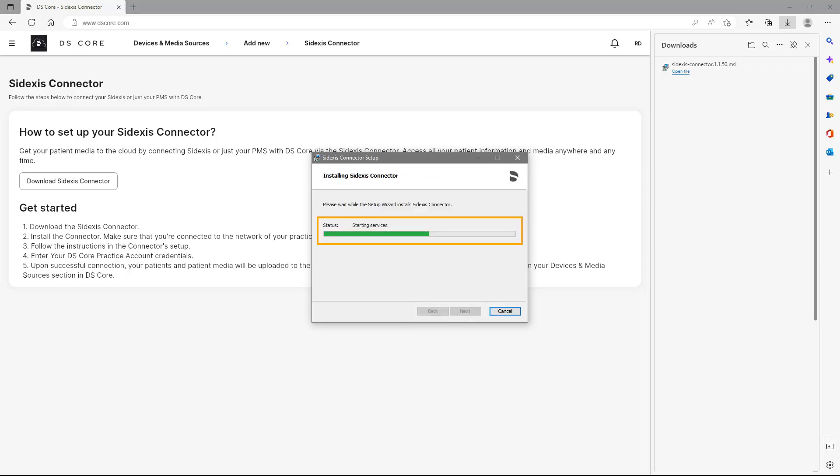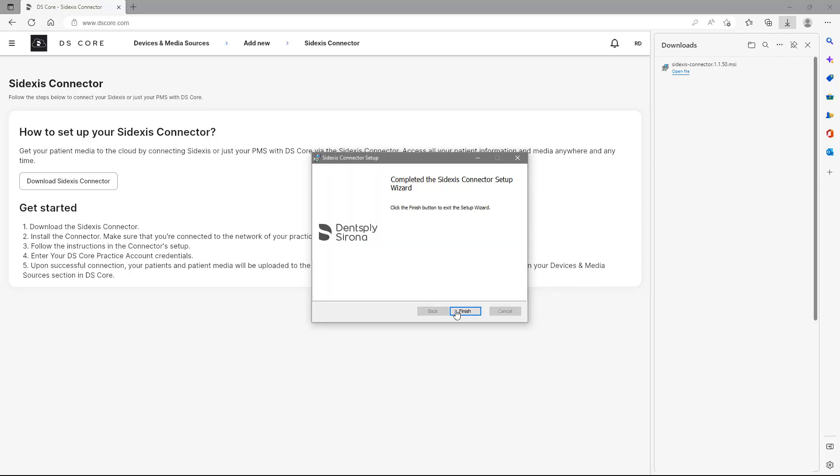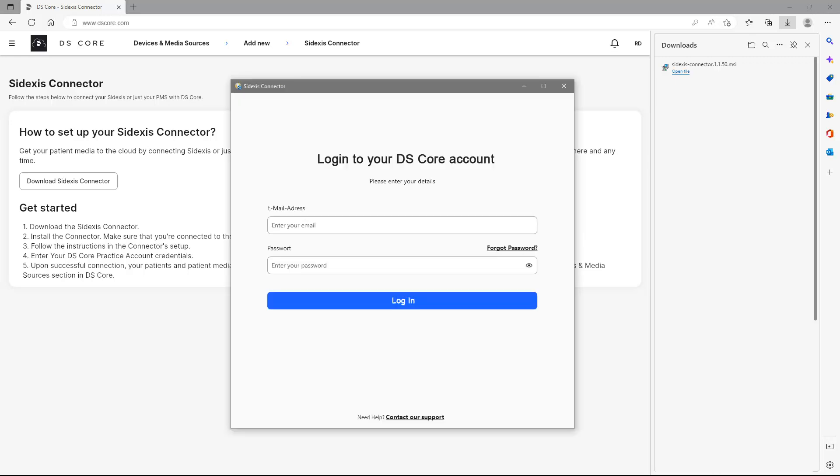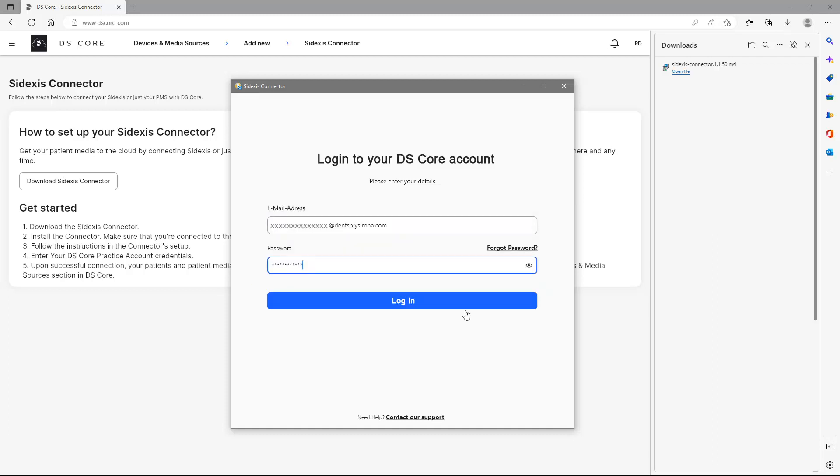The green bar displays the status of the installation. As soon as the installation is completed, we tap on Finish. Now, we will enter our DS Core practice account credentials and confirm with Login.